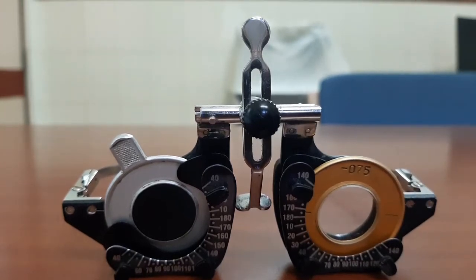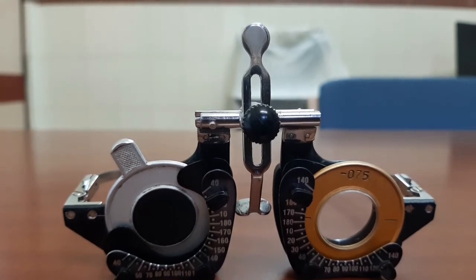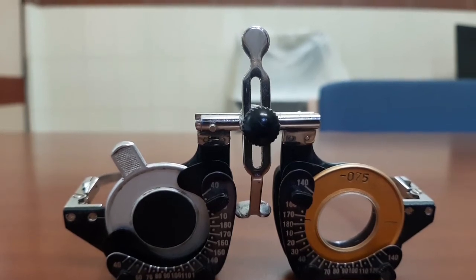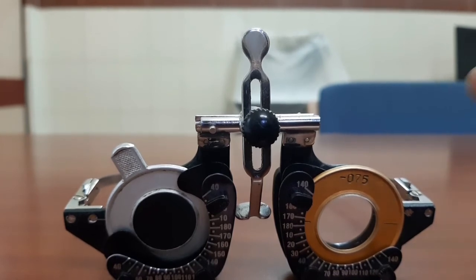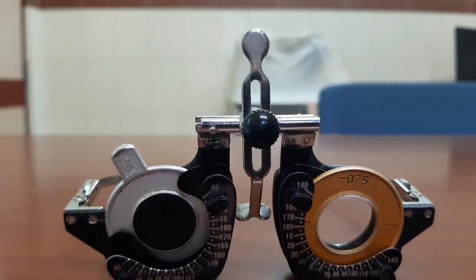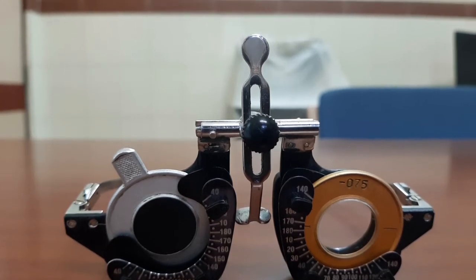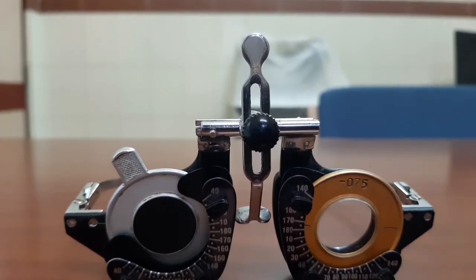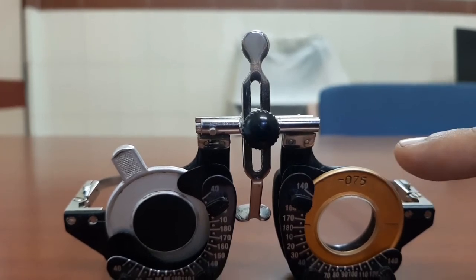How much to move depends on the power of the trial lens. If the cylinder is less than 0.25 diopter, move up to 30 degrees and recheck. For 0.5 diopter cylinder, move 15 degrees. For 0.75 diopter, move 10 degrees. For 1 to 1.75 diopter, move 5 degrees. For 2 to 2.75 diopter, move 3 degrees. For 3 to 4.75 diopter, move 2 degrees. For more than 5 diopter cylinder, move just 1 degree and recheck.